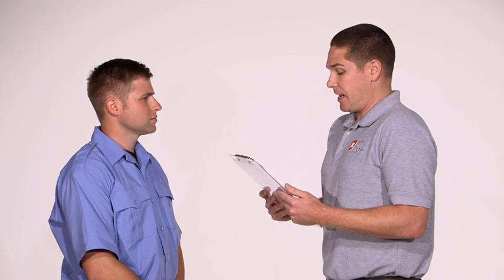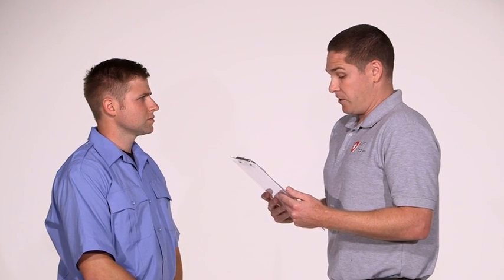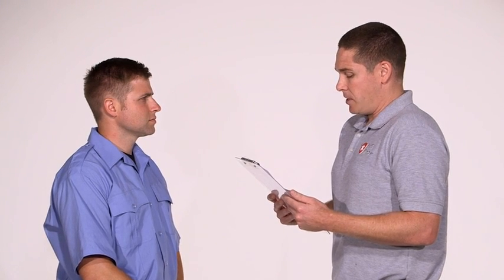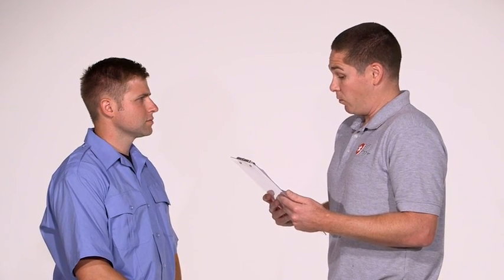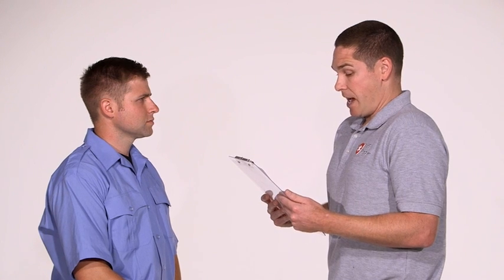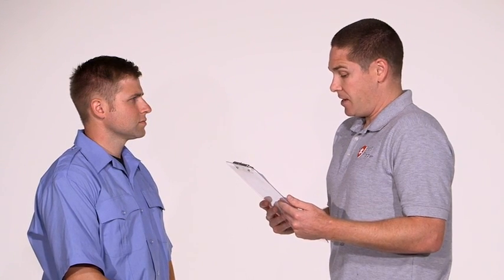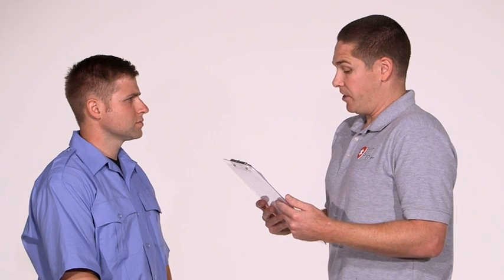If you do not successfully establish the IV, you will not be able to administer the IV bolus of medication to the patient. Although we are using the mannequin arm, you should conduct yourself as if this were a real patient. You should assume that I am the actual patient and ask me any questions that you would normally ask a patient in this situation. After you establish the IV, you will have 3 minutes to begin IV administration of a bolus of medication. Do you have any questions?